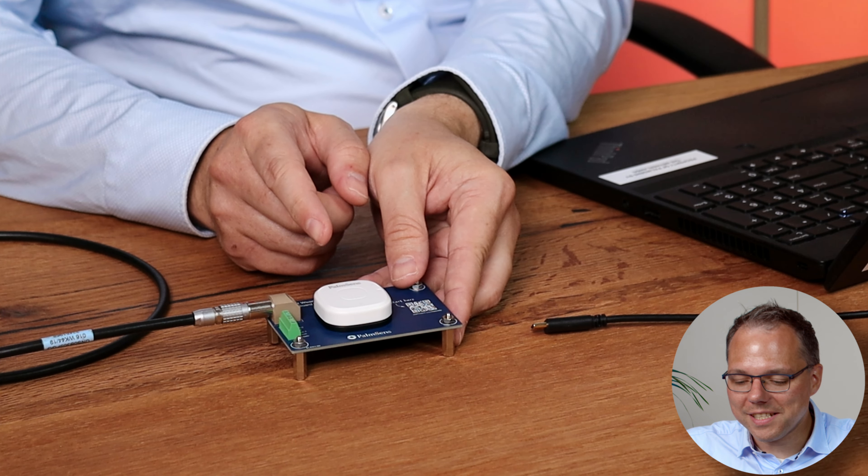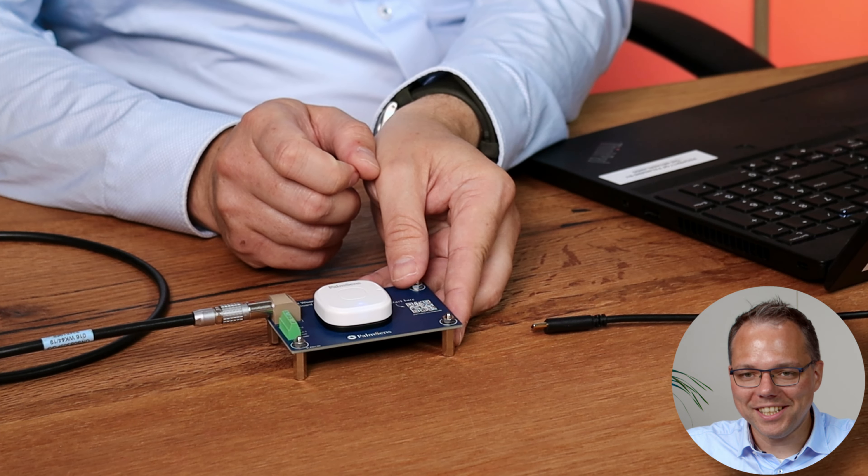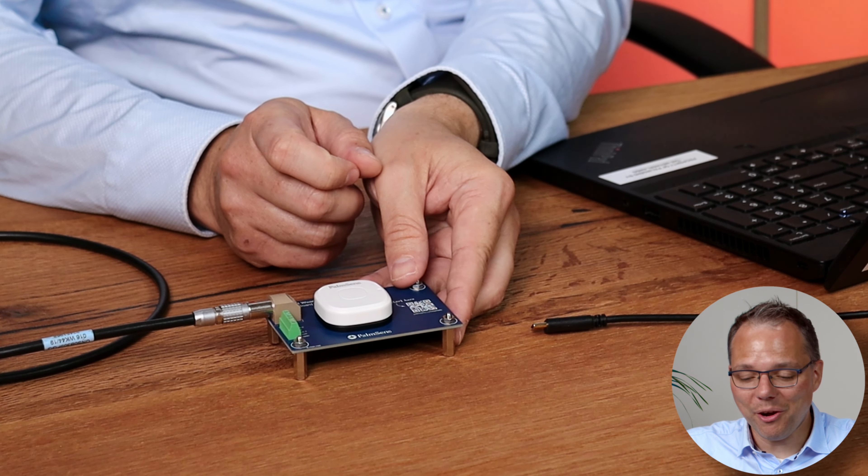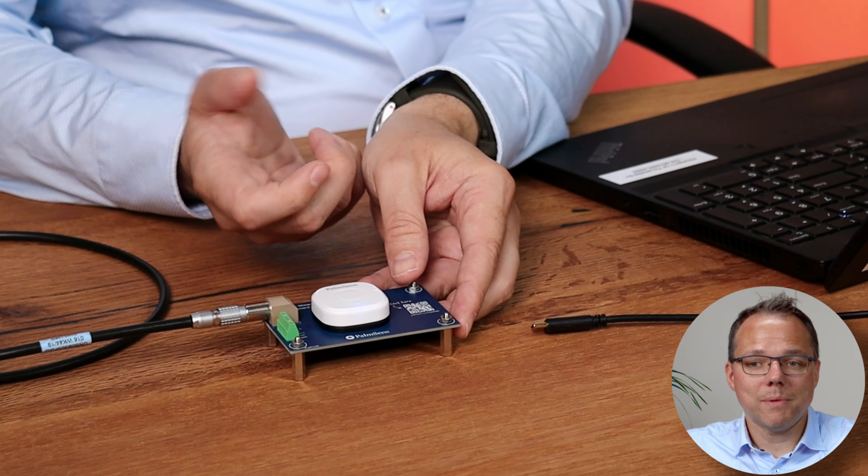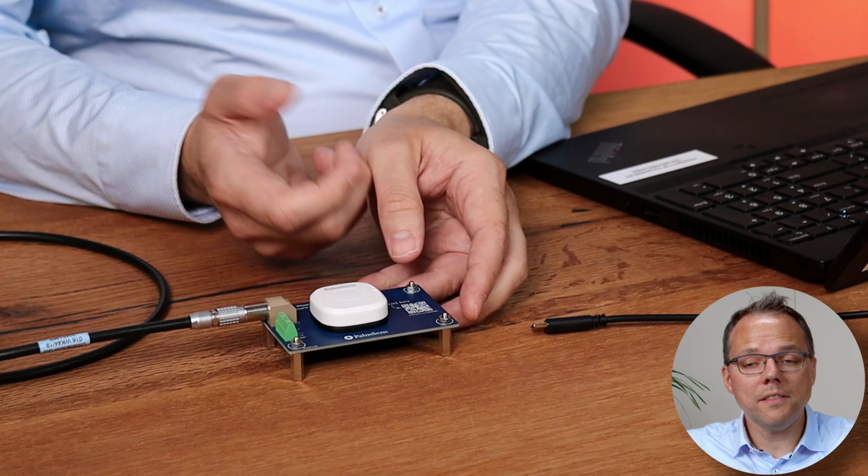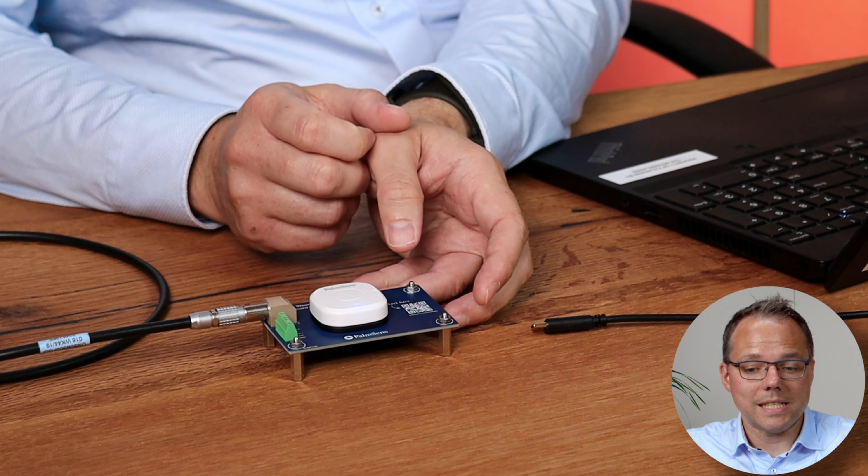When the light is blinking again just like now it means the measurement is done and the Sensit wearable is idle.